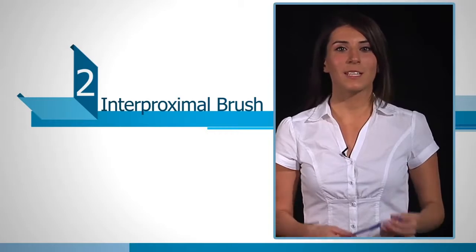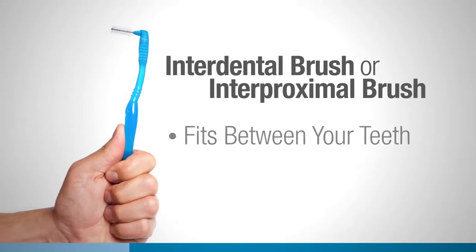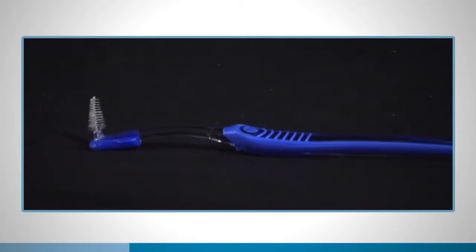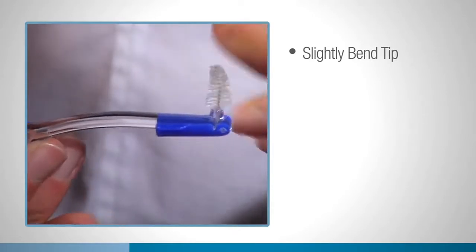This little brush is a must-have if you're wearing braces. It's called an interdental brush or an interproximal brush, meaning it fits between your teeth. At the end of the interproximal brush is a metal tip that can cause gum damage if not used correctly. Prior to using the brush, slightly bend the tip.